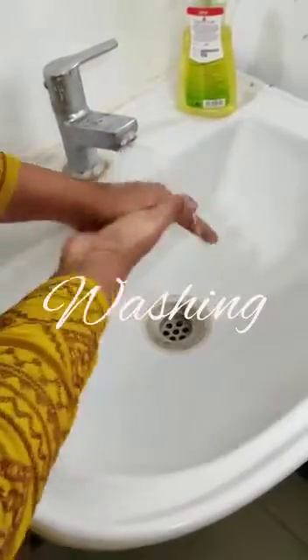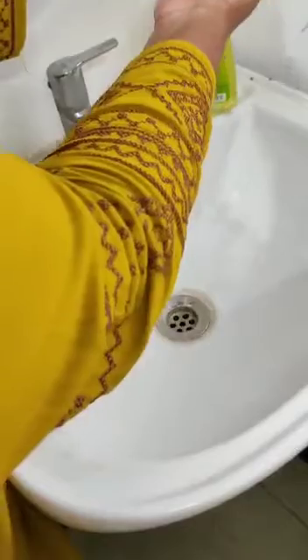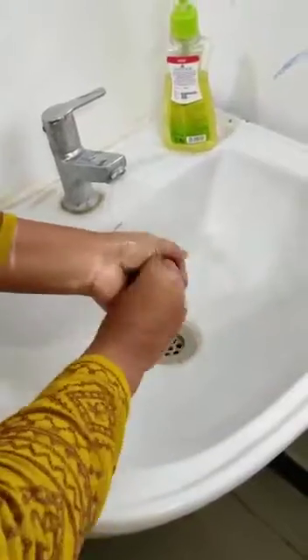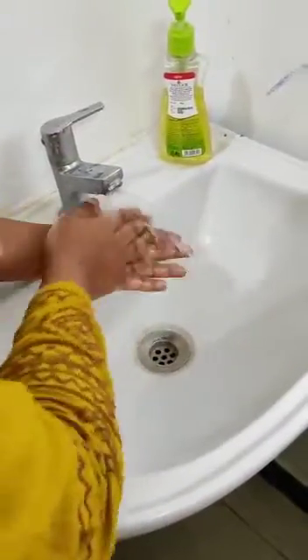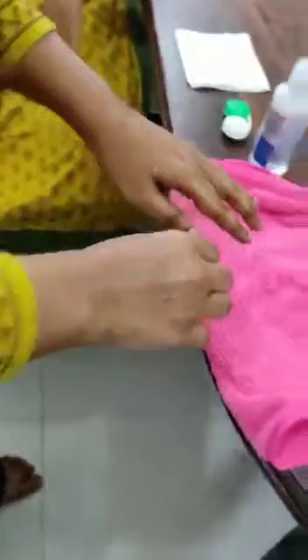The first step is washing. We should wash our hands thoroughly using hand wash, and rinse it well. Now dry your hands using a clean towel.